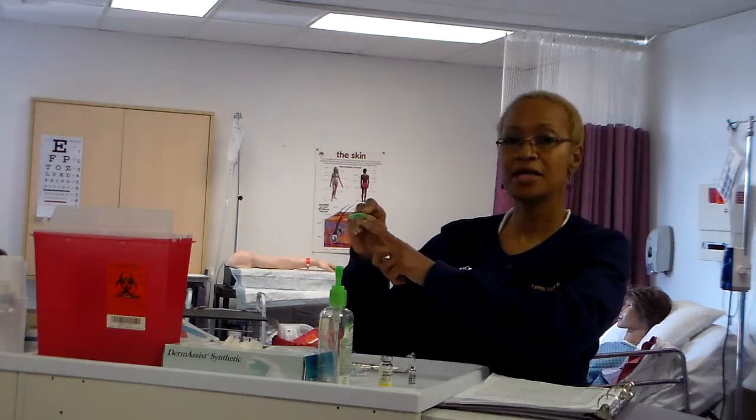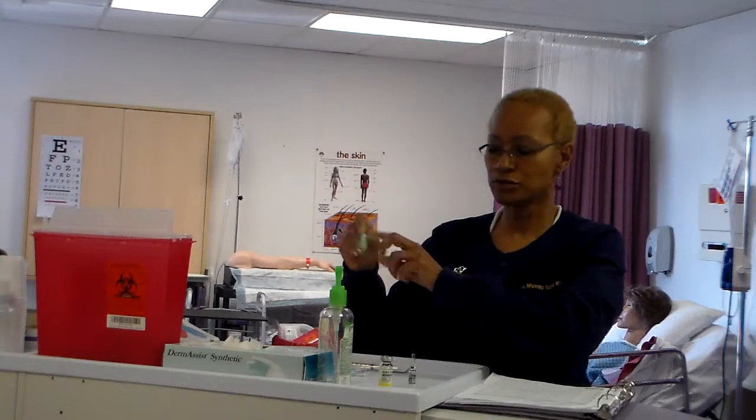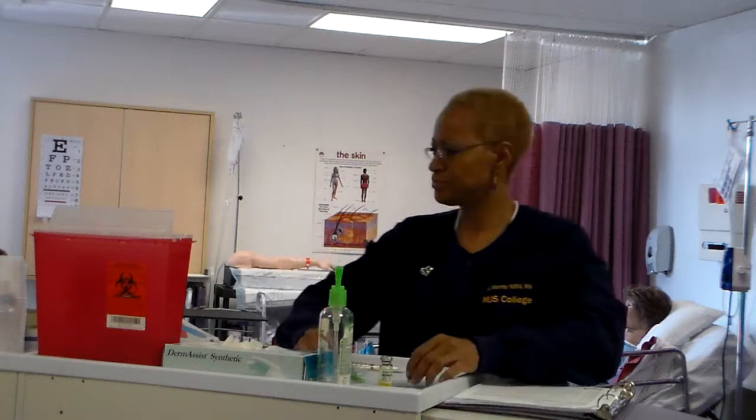The reason you need a filter needle is because once you open the ampule, it has a scored section, and that scored section may drop little pieces of glass into the medication. So you must use a filter needle with an ampule.